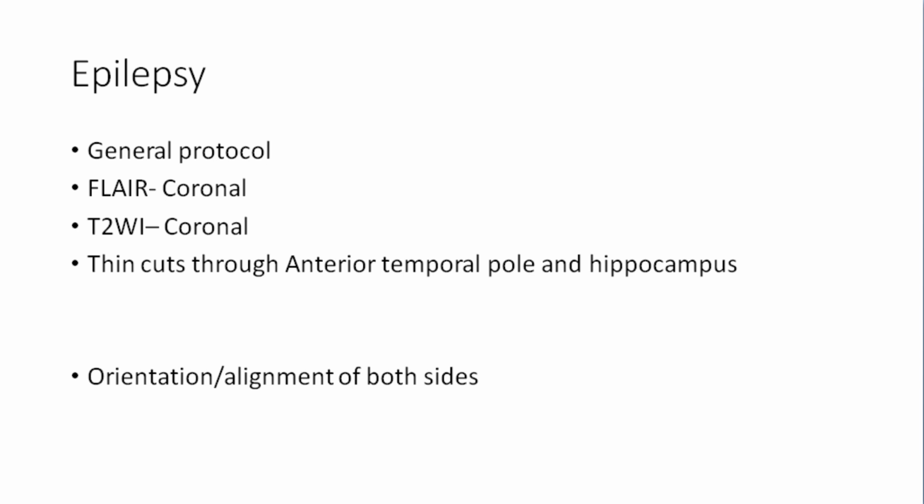Mesial temporal sclerosis. Okay. Because as a radiologist, you don't get the whole detail. You don't get the history maybe most of the time. But you have the right to ask the clinician why they're doing the scan. At least write down one line, or one word, like dementia, why I'm doing this scan. You can ask, as a departmental policy, next time if this is not written, why this patient is having an abdominal scan, we cannot scan the whole tummy. Saves time. You want to look at the liver? We will look at the liver. We will reduce the cost for the patient and time for you guys and increase the productivity.